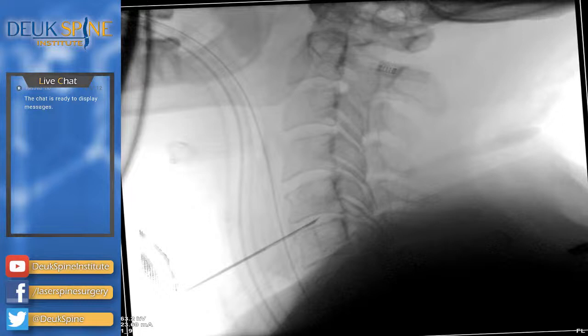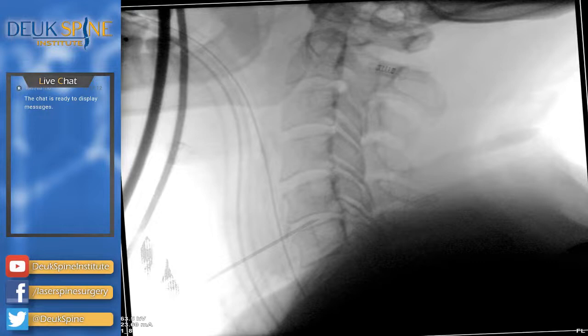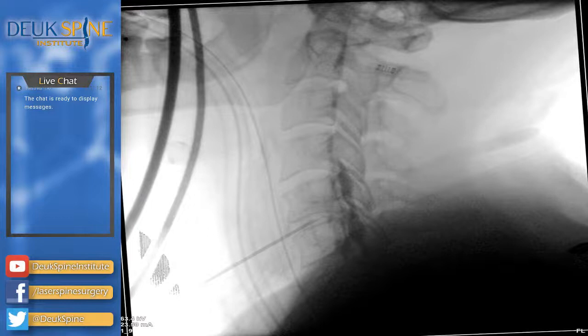All right, this is just before we inject dye. I felt the dye go in. Wow, look at the tear in the back of the disc. That's massive. All the dye has leaked out through the tear in literally a microsecond. That's how big the tear is. And it's now around the dura and the nerve roots. Pretty cool. You can actually see the indentation of the herniation back there as well.